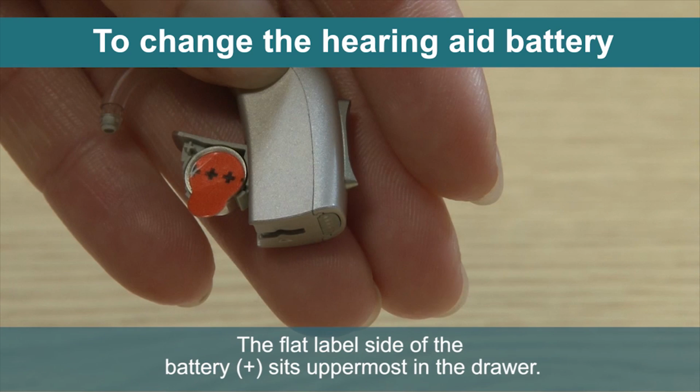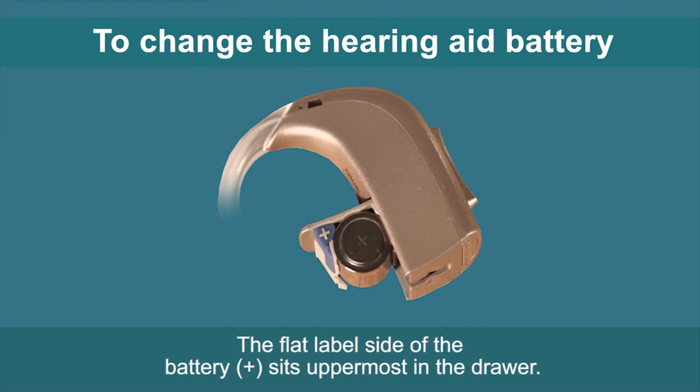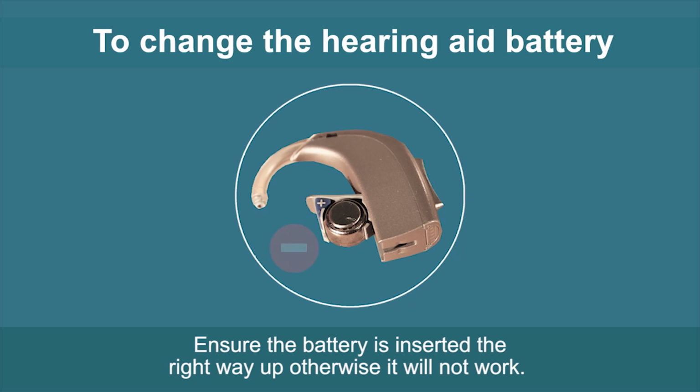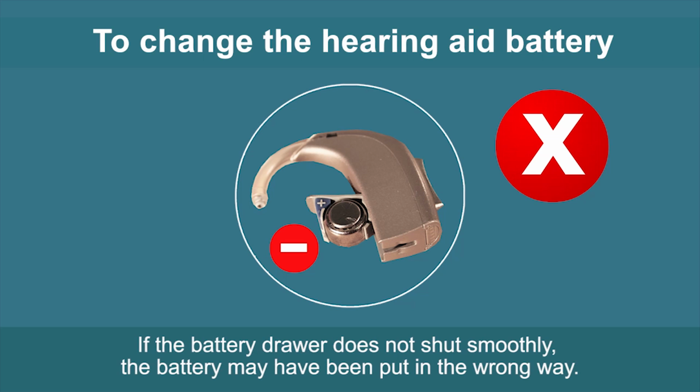The flat label side of the battery sits uppermost in the drawer. If you can see the markings, use them as a guide. Ensure the battery is inserted the right way up, otherwise it will not work. If the battery drawer does not shut smoothly, the battery may have been put in the wrong way.